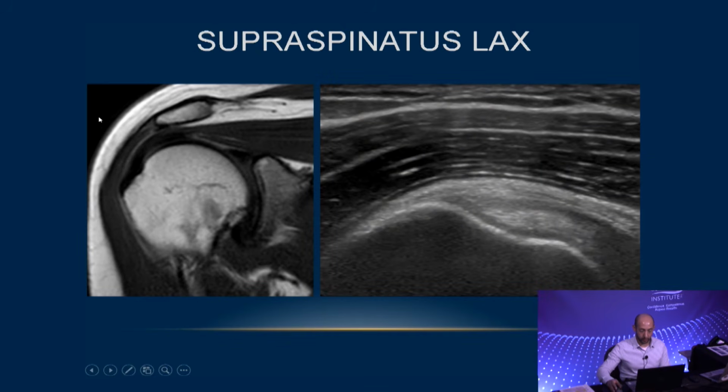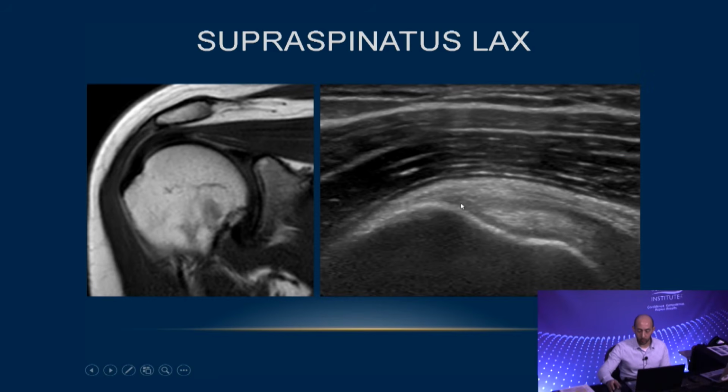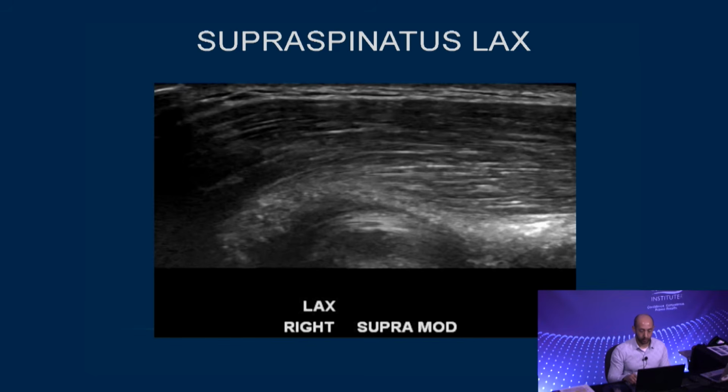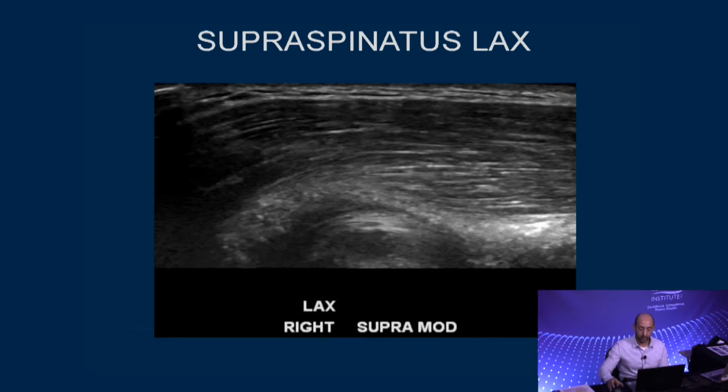So here we're oriented on this part of the shoulder. You can see that when we are far anteriorly, the supraspinatus tendon has more of a bird's beak appearance. The greater tuberosity has more of an angle here, and as you go more posteriorly, getting towards the infraspinatus at that middle facet, it is going to flatten out a bit. So the superior facet has more of an angle, almost like a bird's beak, and as you go more posteriorly into the infra, you'll see it start to flatten out going into the infraspinatus and into the overlap region.